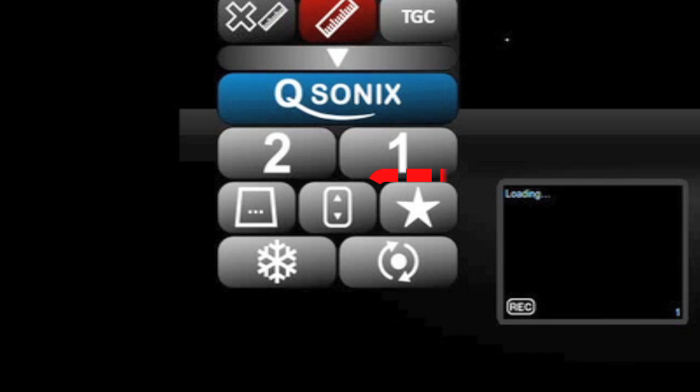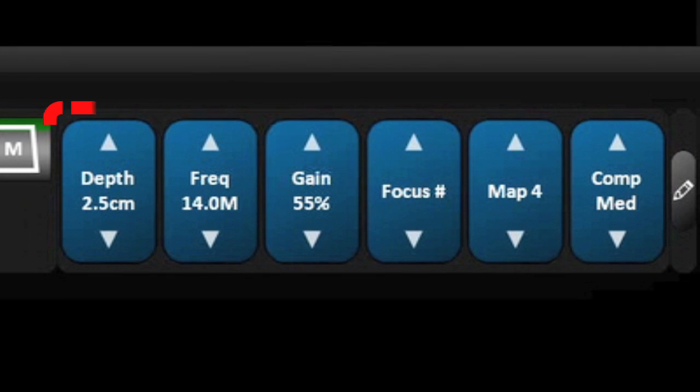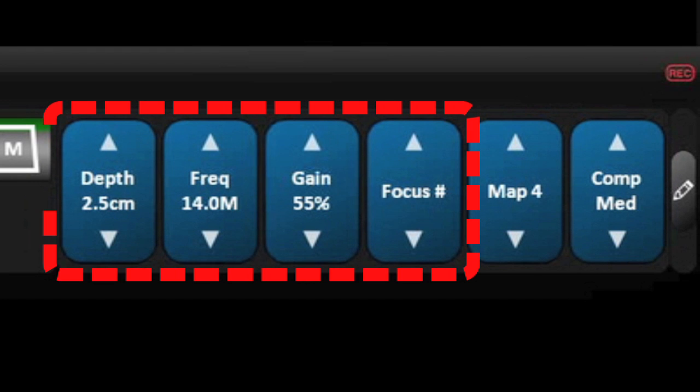Remember you can make further changes to optimize the image by opening the favorites drawer to make changes to the depth, the frequency, the overall gain, and the number of focal points.